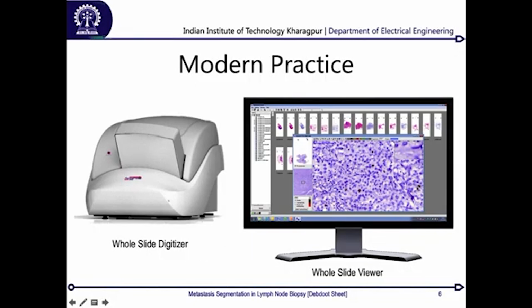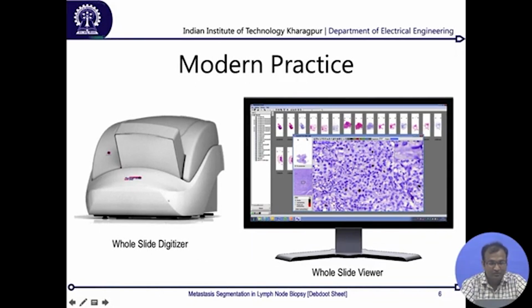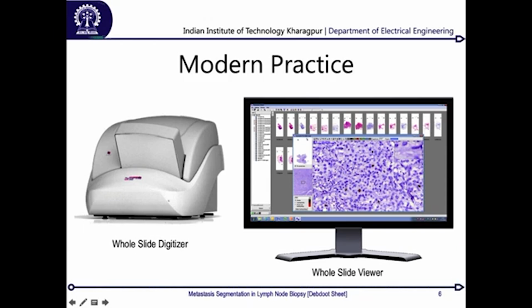a whole slide image. Now it's pretty good, because what you would see in this kind of whole slide viewing workstation is a virtual slide showing where the mass of tissue is. Since you could scan the whole slide, you have a thumbnail, and you can pick whichever slide you want to see, and then magnify to whichever region you want to see. Since it's scanned at different optical magnifications, you can emulate the same kind of behavior. The good thing is that you no longer need to sit at a physical microscope. The pathologist can get digitized images coming over the internet to him at some other location, and the images might be digitized at some other place.